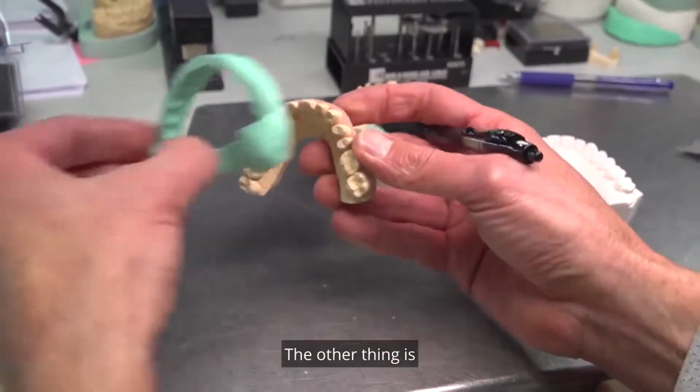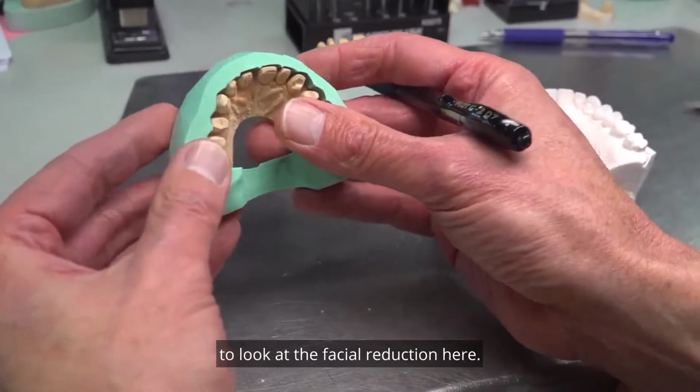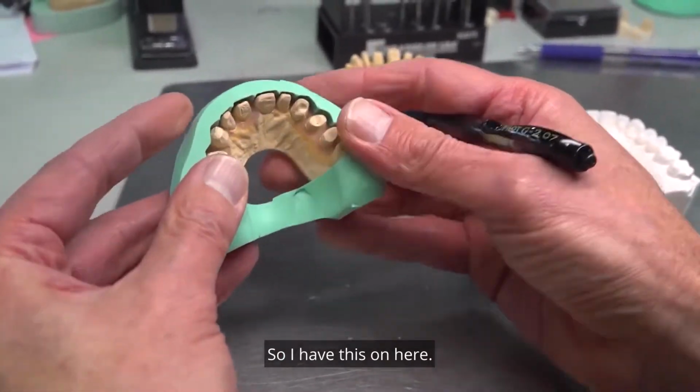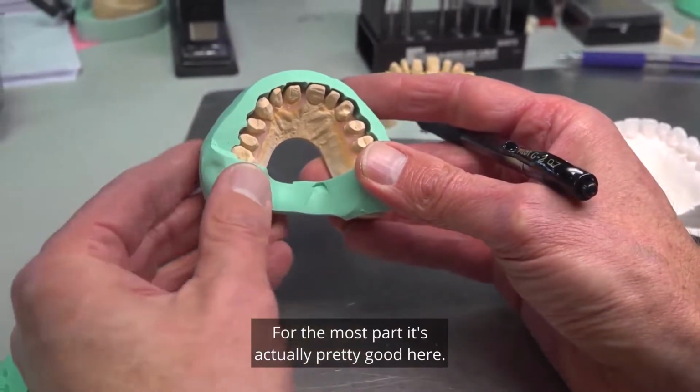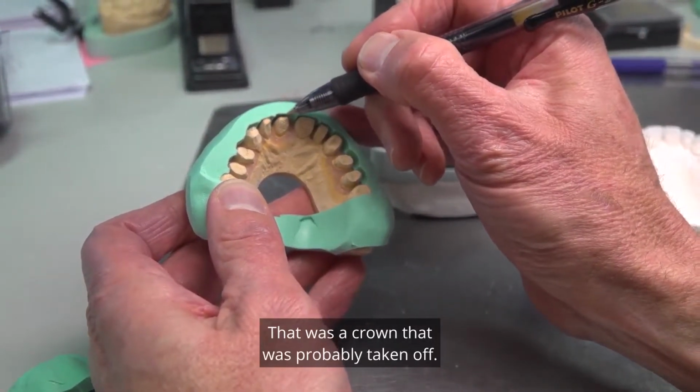The other thing is that here's the putty matrix to look at the facial reduction. So I have this on here. You can take a look. For the most part, it's actually pretty good. As we get around here, a little bit thin. That was a crown that was probably taken off.